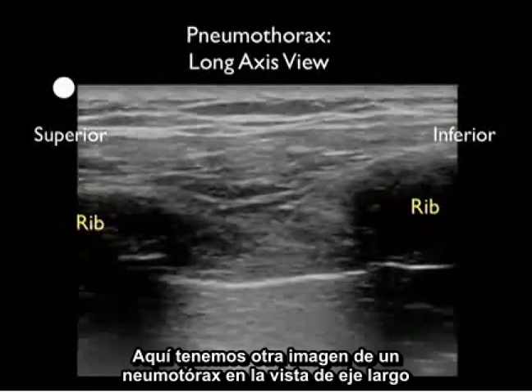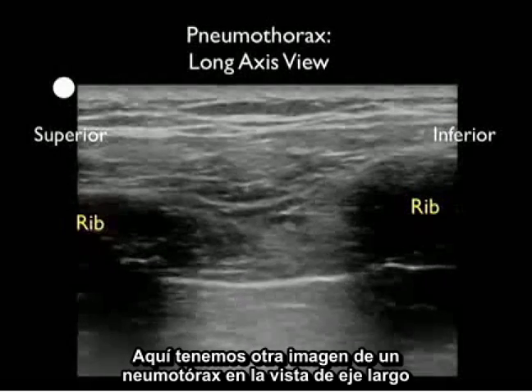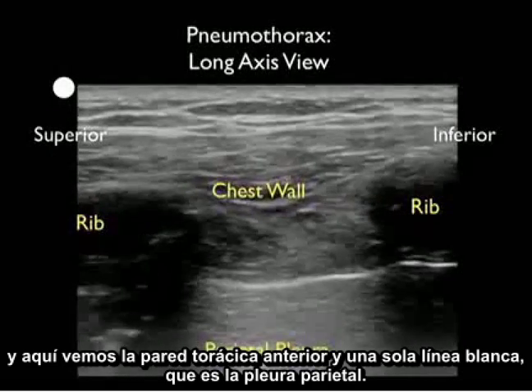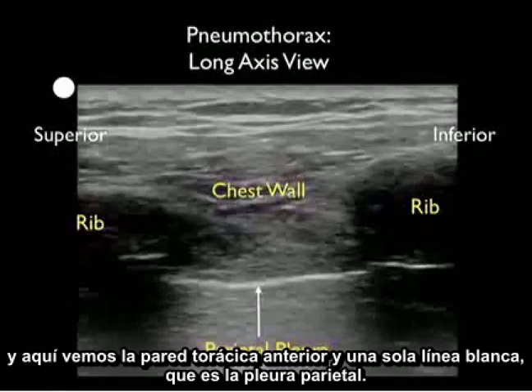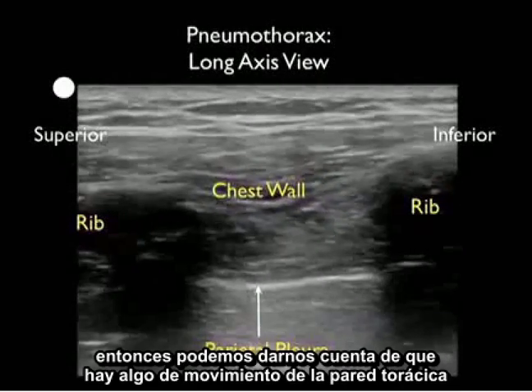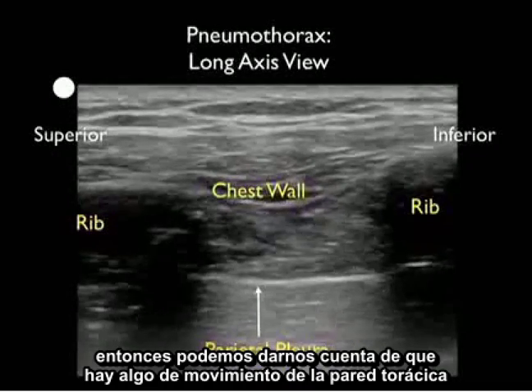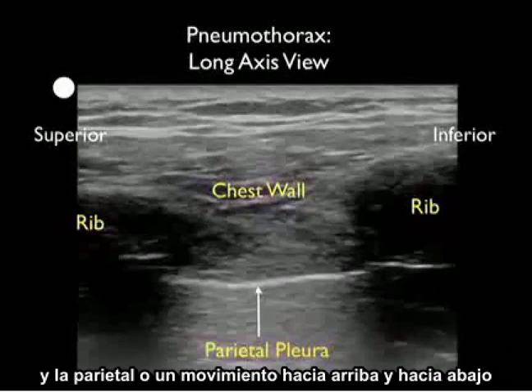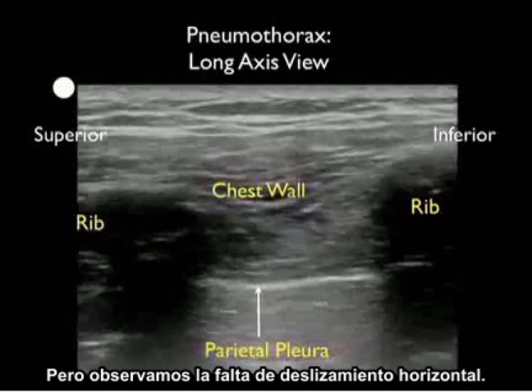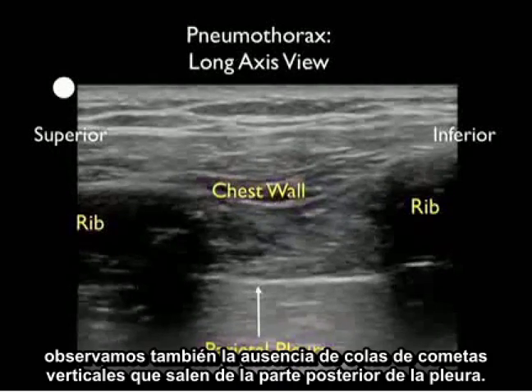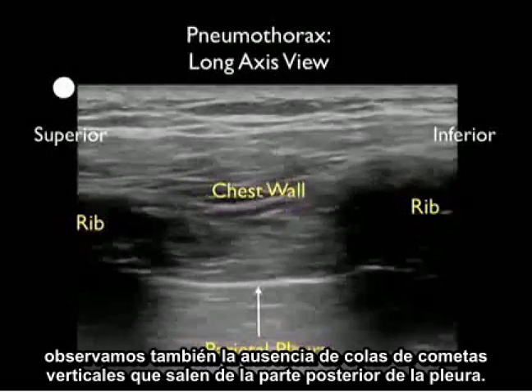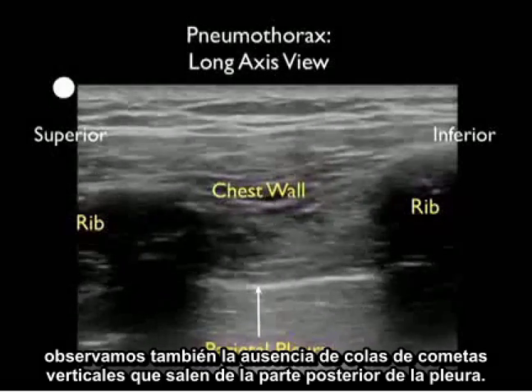Here's another image of a pneumothorax in a long axis configuration. We see the chest wall anteriorly and the single white line which is the parietal pleura. This patient was acutely dyspneic, so notice there is some motion of the chest wall and the parietal pleura moves up and down, but notice the failure of horizontal sliding and the absence of any vertical comet tails coming off the back of the pleura.